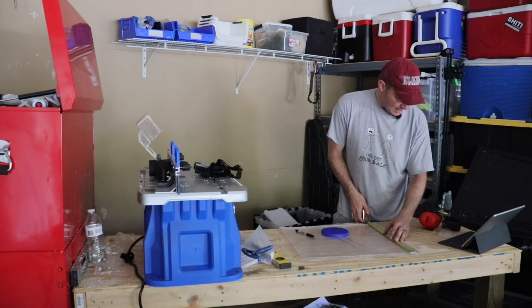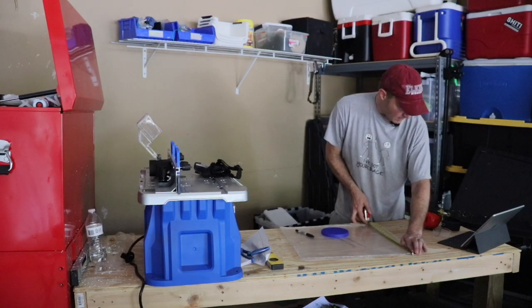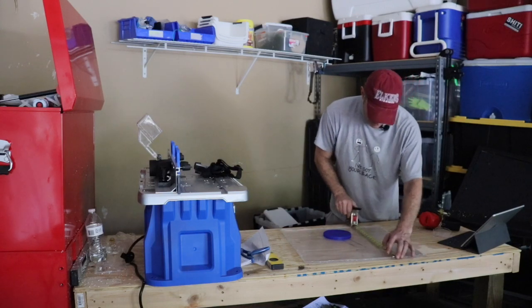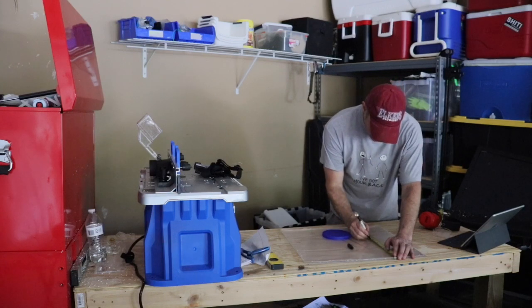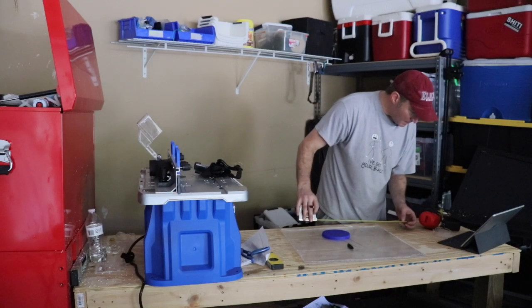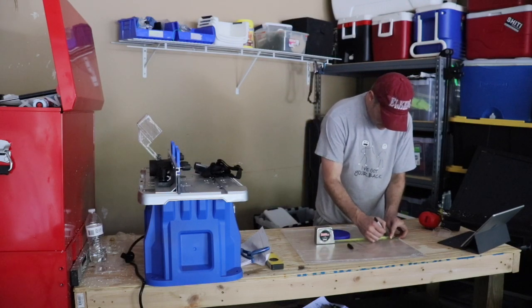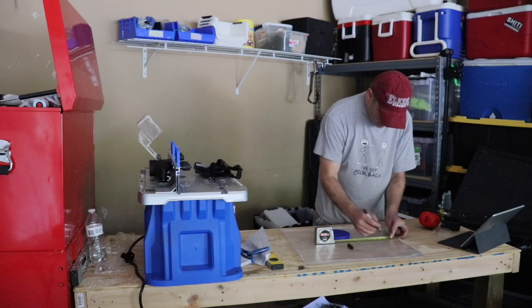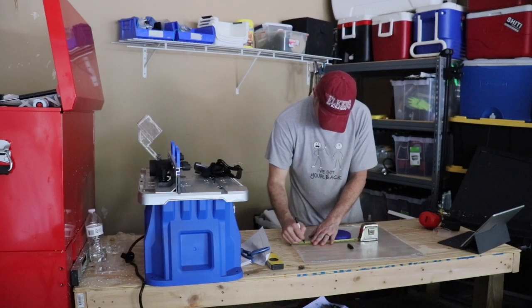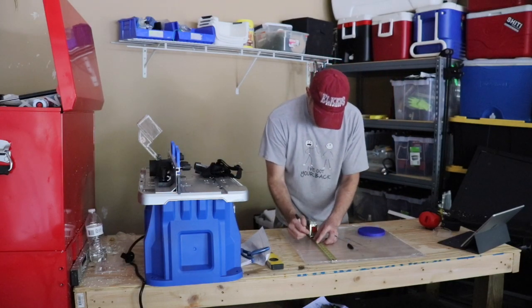make sure I'm on the right side, 19.5 inches, 20.5 inches, yep. So I'm going to come down. Their recommendation is 9.75, so I'll come down 9.75, make a mark, and then the edge is supposed to be 2 inches from the left. I'm going to go about 2 1/4, just to give myself a little extra space on the edge. 2 1/4 across, 9 3/4 down.